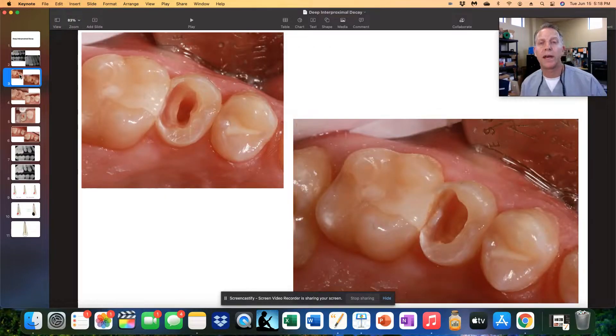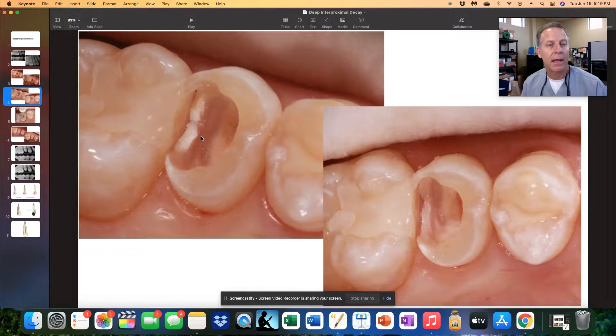Here's the decay after it's been removed. I tilted the camera sideways, and you can still see right here that is still some enamel — some demineralized enamel right there. This is really dug out deep inside; you'll see a post-op x-ray in a moment to show how deep it really went. Here's a closer view. All the decay is gone — I went with the slow speed and really dug out everything.